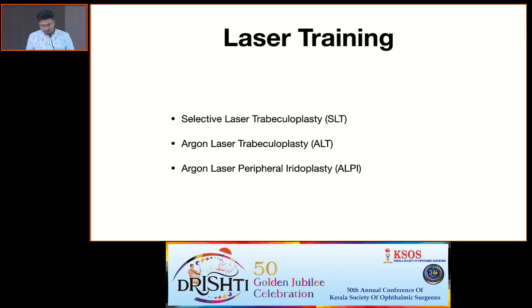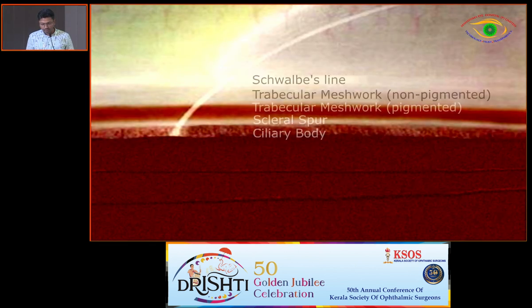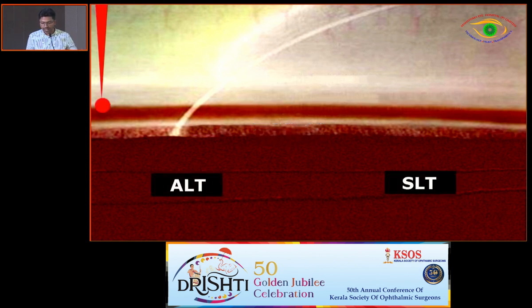So when you look into the training part of gonioscopy, the application of gonioscopy is always there in the intraoperative setting and in the lasers which you are going to give. We can demonstrate this in selective laser trabeculoplasty, argon laser trabeculoplasty, and ALP, argon laser peripheral iridoplasty. I'm going to demonstrate what is happening, again with the normal animated video, which very clearly shows the spot size of the argon laser trabeculoplasty, and how we give the selective laser trabeculoplasty in such scenarios.